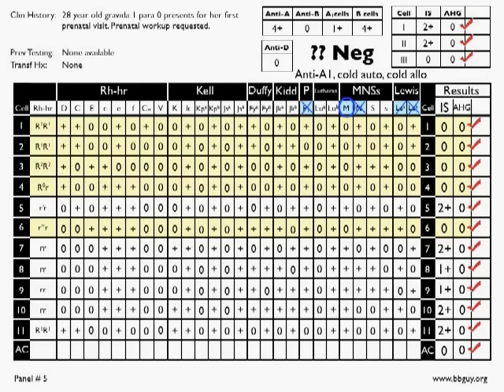In fact, let's take a look at it real quickly, just as a preview. You can see every place there is an M antigen present, there is reaction, and the reactions correspond well with single dose versus double dose. So this is probably an anti-M. Again, this is for the exam world. You can knock out that ID in just a matter of moments.